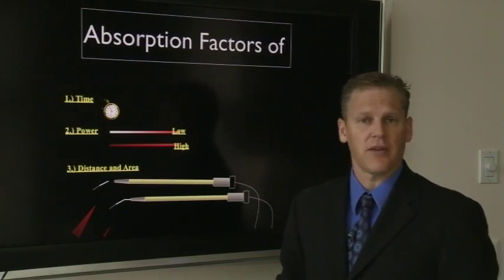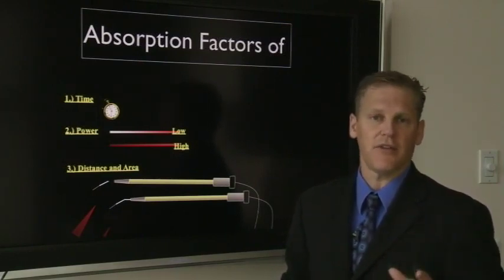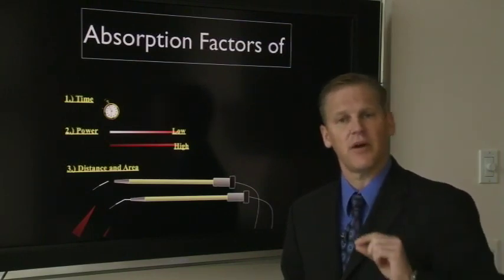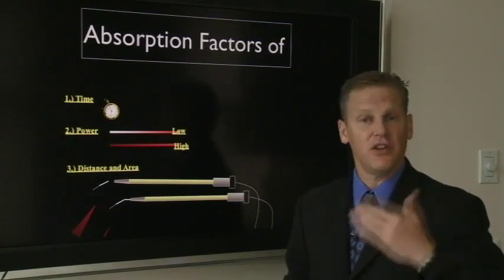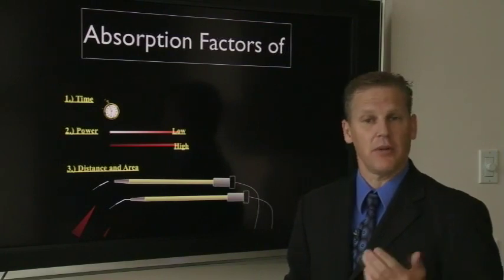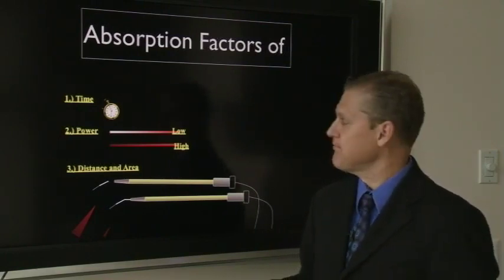And I asked him about the amount of magnification he was using. He said, no, I'm not using any magnification. And I said to him, you may find that your power densities will decrease if you just simply increase the amount of magnification by 2 or 2.5 times. You may find that you are decreasing the level of interaction that's going to happen. You're going to be able to see easier. You're going to be able to use lower settings.